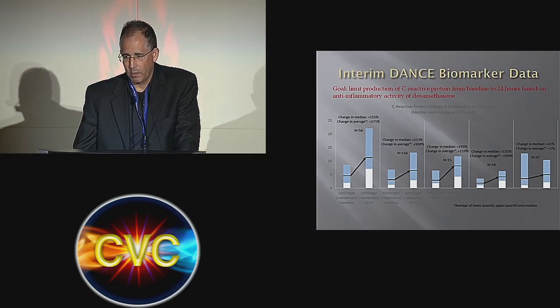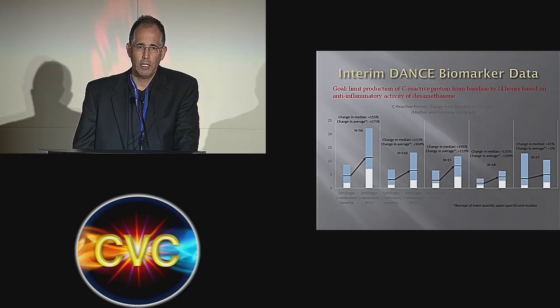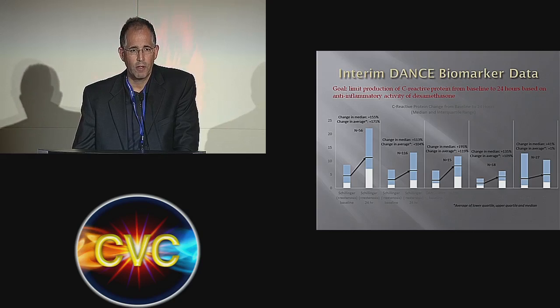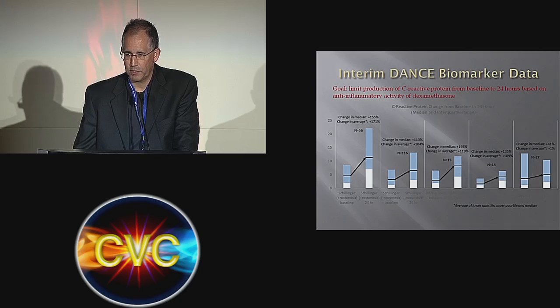The third, middle column then represents what patients look like when they've been treated with atherectomy and the Bullfrog device following their intravascular therapy. So it basically reduces the inflammatory response to that of non-restenosers, looking at all patients. That's just a brief illustration of how biomarkers can be a surrogate for measuring whether or not we're getting effective administration of drug into the vessel wall.